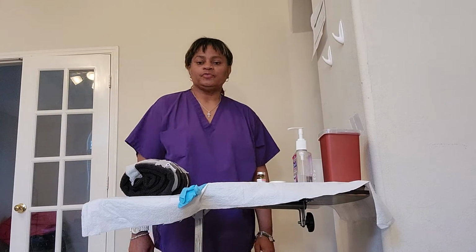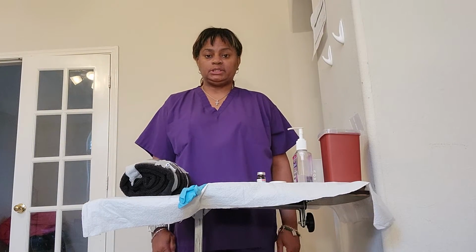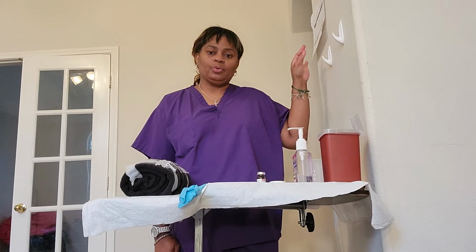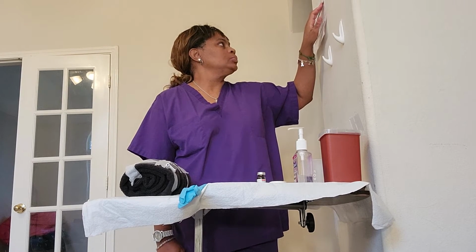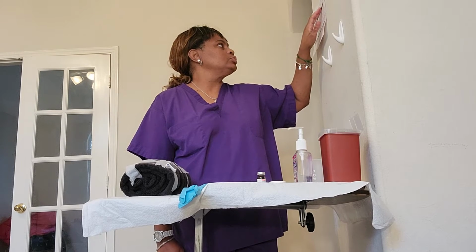Today we're giving medication for Ms. Millie Larson, date of birth 1/1/1936. I'm going to access the MAR to make sure the medication that's ordered matches what I'm about to do. So by accessing her MAR, I'm going to verify Millie Larson, 1/1/1936, MRN 123456.